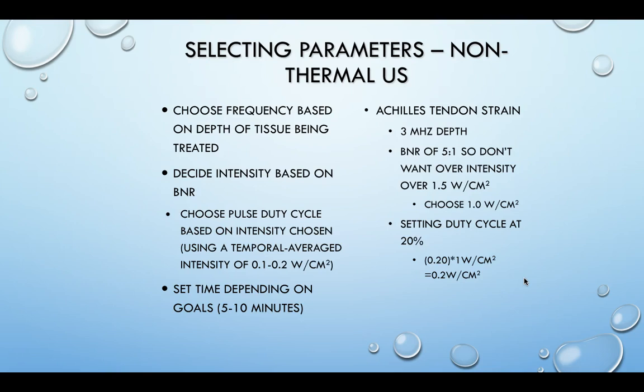So let's go with an Achilles tendon strain, right? Something that's acute, just happened. We want to target the Achilles tendon, which is rich in collagen. So we know ultrasound will be great for that. We want to stimulate that into the healing mode, but we don't want to produce any heat.